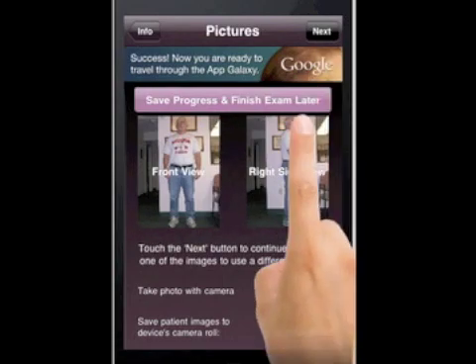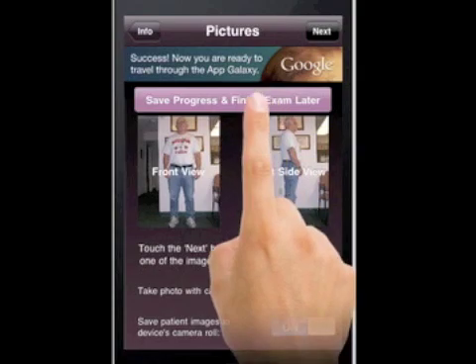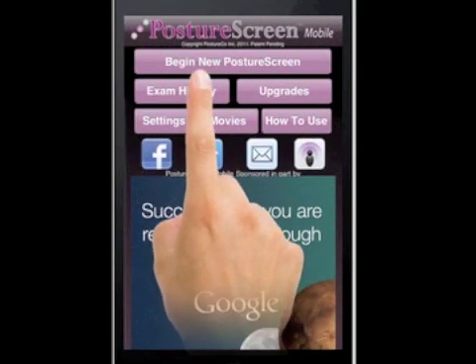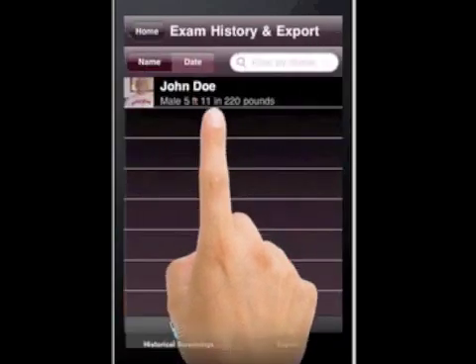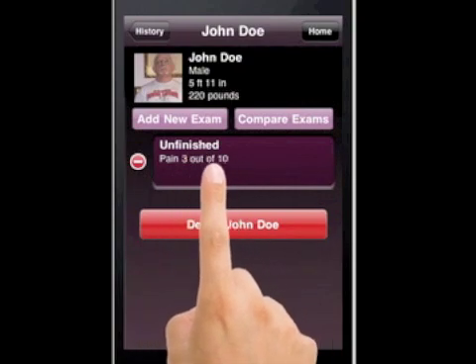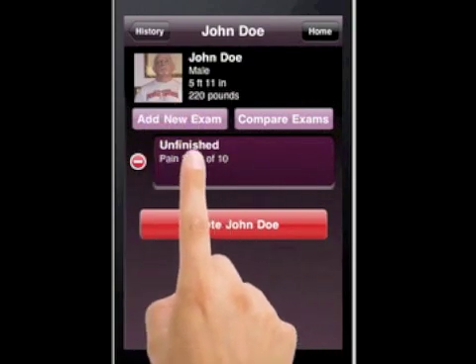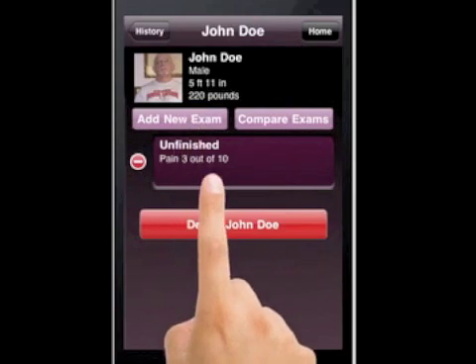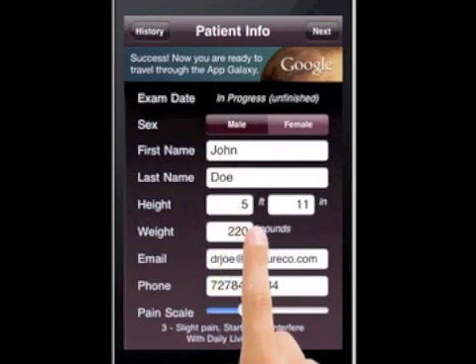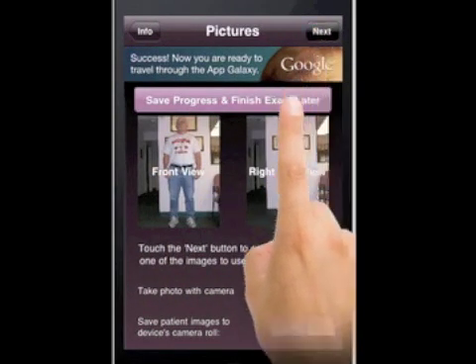The next step: if you wanted to come back later and do the exam — say you had a whole bunch of people come in — all you have to do is hit Save Progress and come back later. If you hit Exam History, there's John Doe right here. You can see it's an unfinished exam. If we wanted to add yet another exam, all we would do is hit Add New Exam. The information is already in there and unchanged — this is where we left off. We're going to go ahead and hit Next.